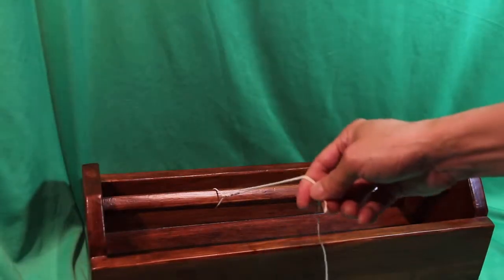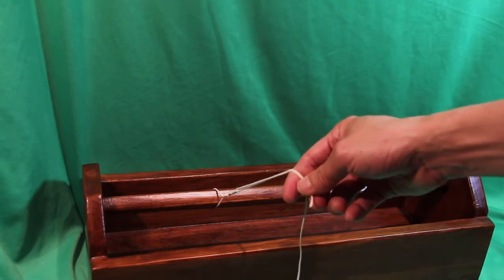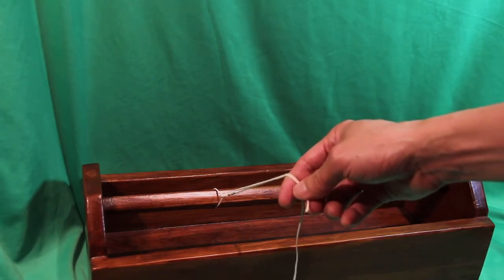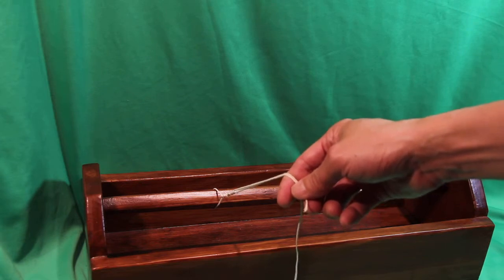And this is how you tie a two-handed square knot, which is a surgical knot. Thank you.